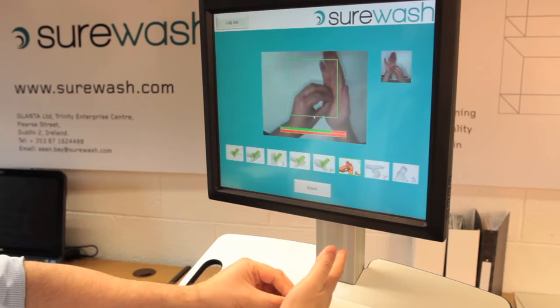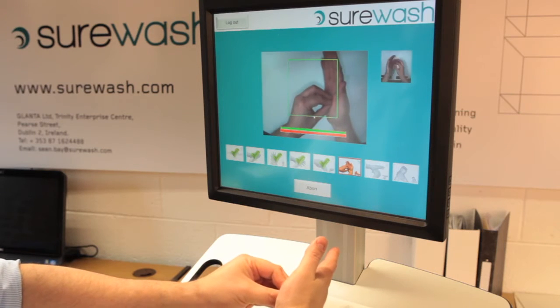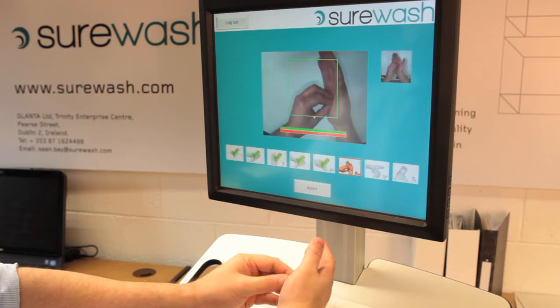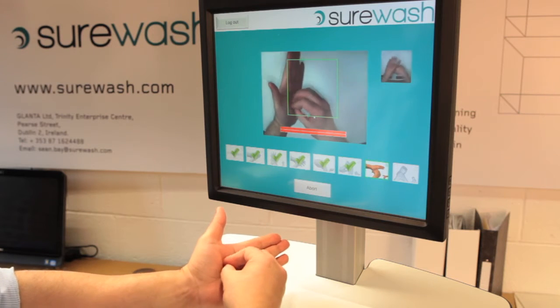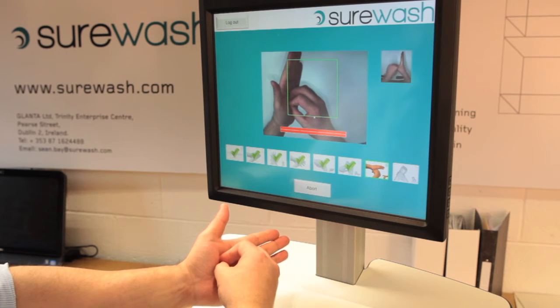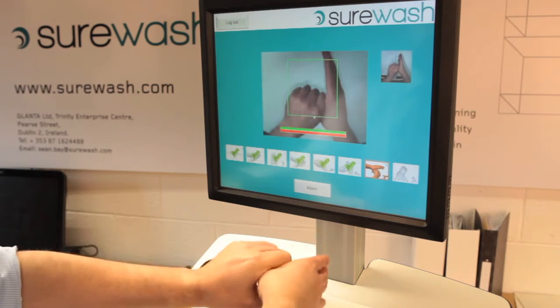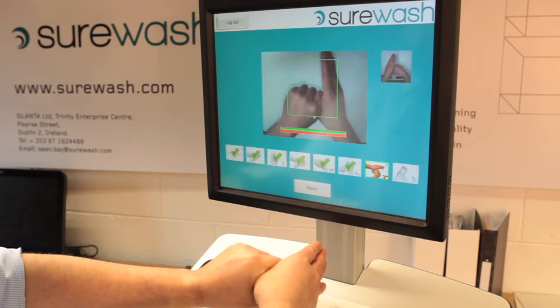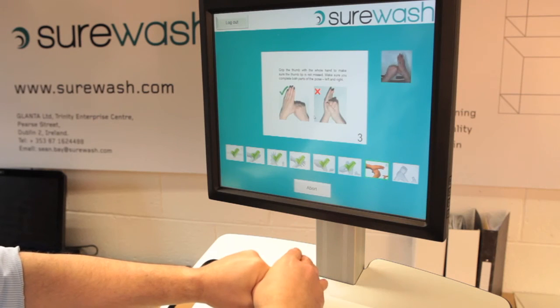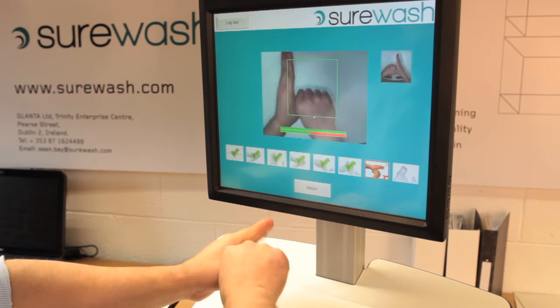So the system now has allowed me to do the right pose, and what it's doing is it's waiting for me to actually activate the left hand. So when I move to my left hand, you can see how it picks up that my left hand has moved. Now it's waiting for me to move to pose 6, which is my thumb, and I'll start with my right thumb. Having done my right thumb, the system is now waiting for me to do my left thumb. It reminds me that you also need to do both. So now I do my left thumb.